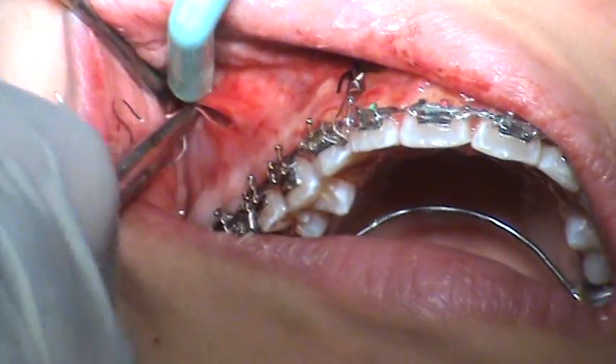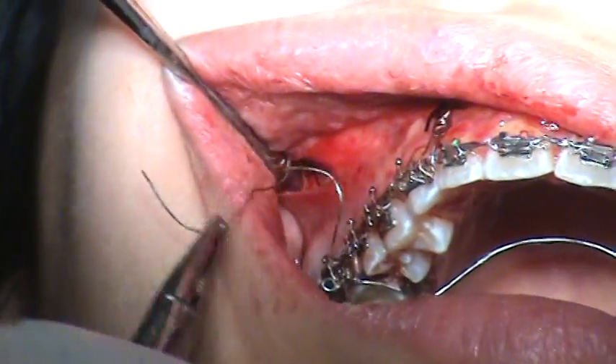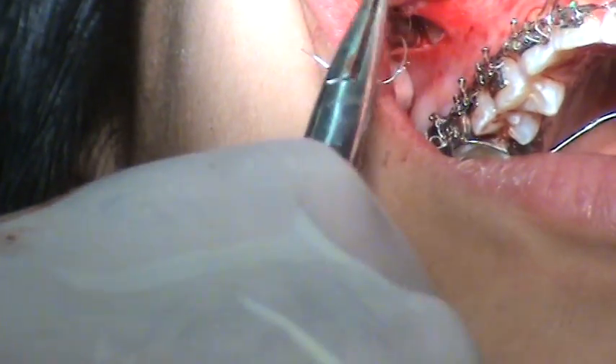You're on the tissue. OK. Let's put a coil on the other one.